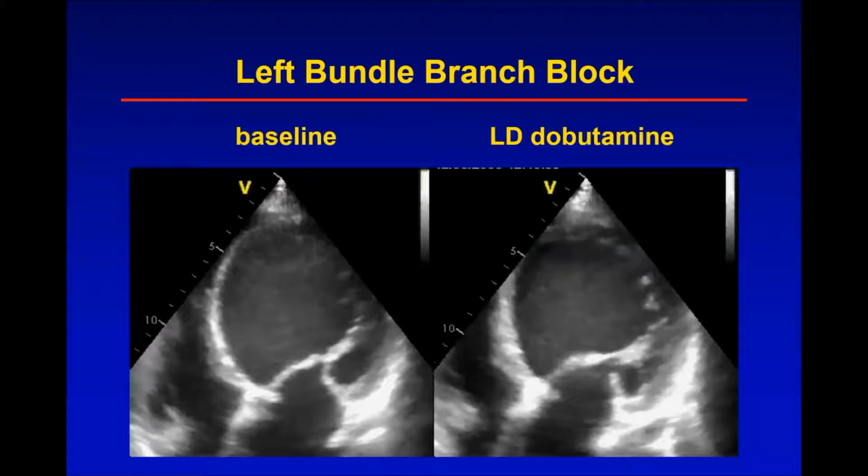We have to measure the local function of the myocardium. How can we do that? We do the same thing. We use this concept of the pressure volume loop, but we try to apply it locally.